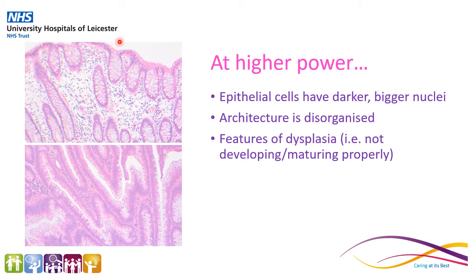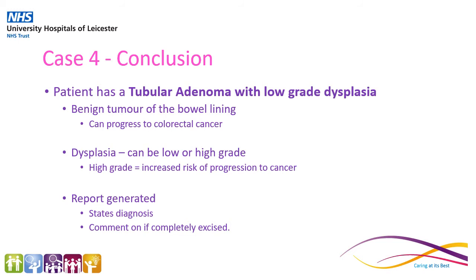Looking at higher power, we've got a picture of the normal bowel mucosa and then a picture of the polyp. Within the polyp, the epithelial cells have bigger, darker nuclei and the architecture of the glands is much more disorganised, whereas within the normal bowel mucosa they should be quite straight and regular. These are features of dysplasia, i.e. the epithelium is not developing properly. This patient has a tubular adenoma with low-grade dysplasia. A tubular adenoma is a polyp, a benign tumour of the bowel lining, but it can progress to cancer. They all show dysplasia and this may be low or high-grade — if it's high-grade, there is an increased risk of progression to cancer. We would generate a report stating the diagnosis and commenting on if the polyp had been completely removed.